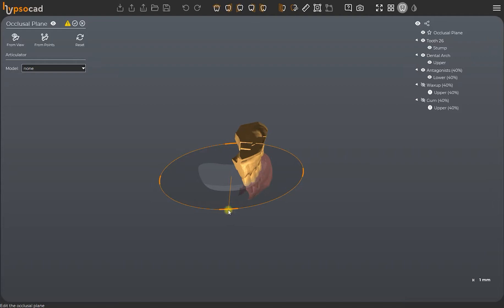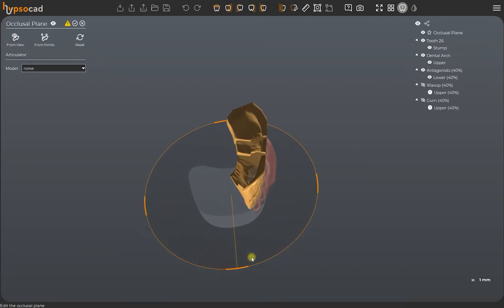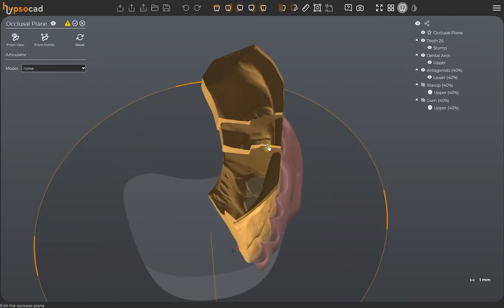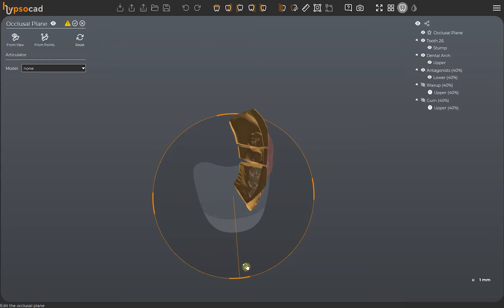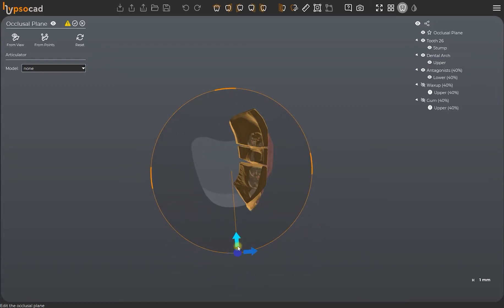On each pole, you find a control focal point, which enables you to simply move the plane, or to flip it upside down by double-clicking.